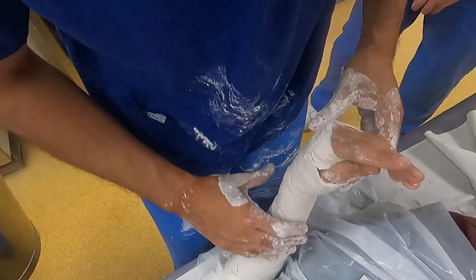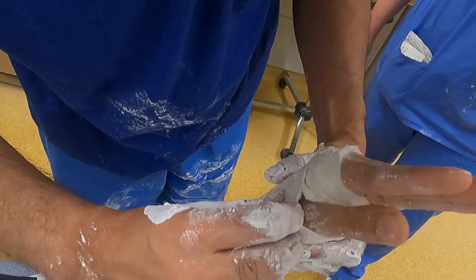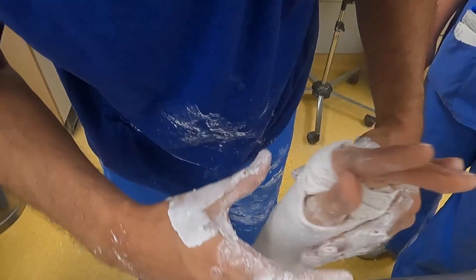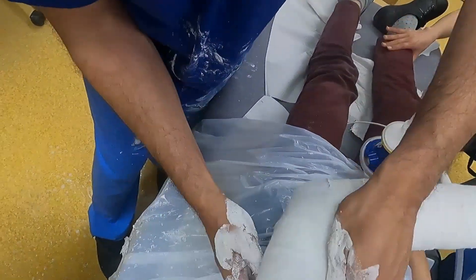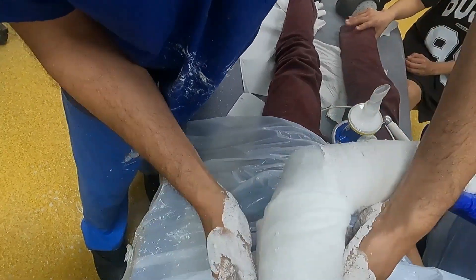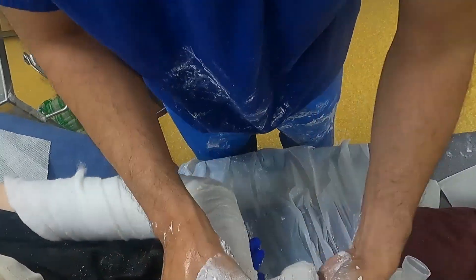Gentle graduated pressure is then applied either side of the apex volar deformity. The plaster is then checked to ensure it's not too tight and the fingers can move freely, with distal neurovascular status reassessed post-reduction. In order to ensure rotational stability, the fracture is then immobilised with an above-elbow cast.